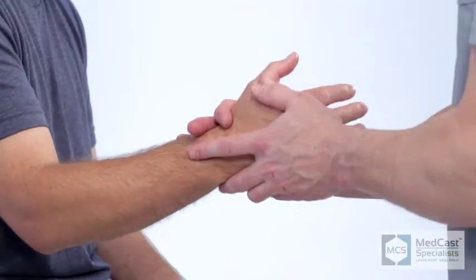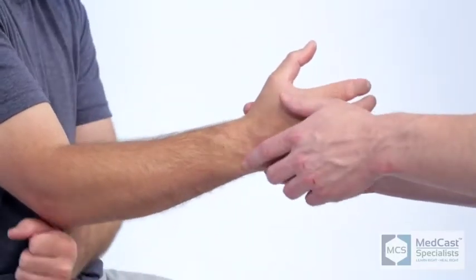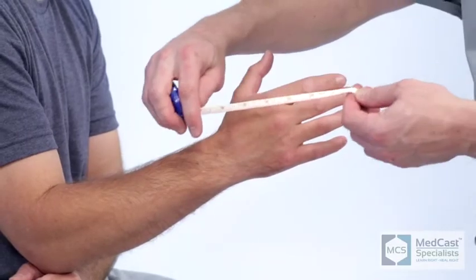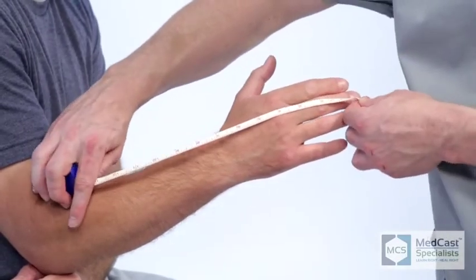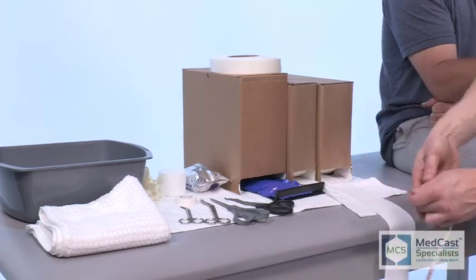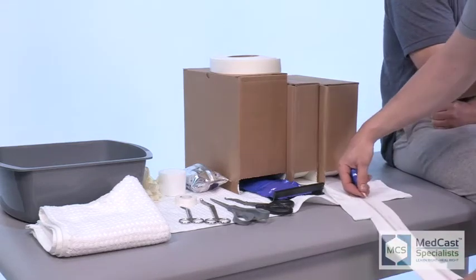We're going to show you the customized application of a radial gutter cast. This is one of the more difficult short arm casts that you'll do. Anytime you incorporate digits, either on the radial side or the ulnar side, it becomes a little complicated. It's a little more technical.